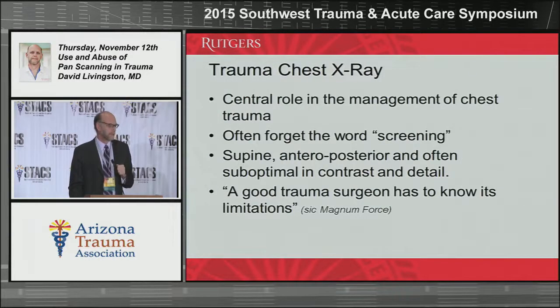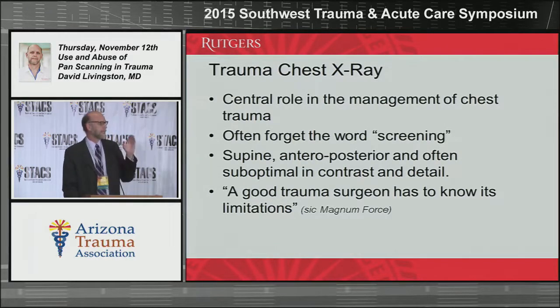Well, what about the trauma chest x-ray? Again, that's still part of your ATLS protocol. Even though some people say you can probably get rid of it, I still think it's really important. I'm a die-hard on this one. People forget the word that it's screening. It is designed to identify the couple, three, four, five things that are going to kill a patient really quick.